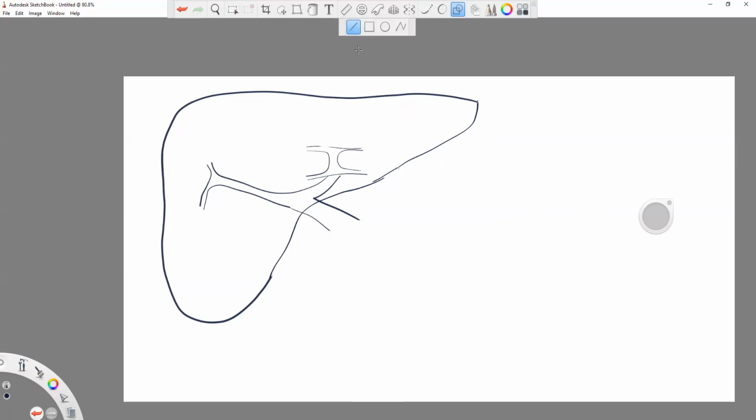In order to get this image, the little man, the umbilical segment here, you are in the epigastrium, transverse, probably a little bit transverse oblique. So you're looking towards more or less the person's right shoulder. And think about that. You're looking towards the right shoulder, but you're still looking at the left lobe. So keep that in mind.